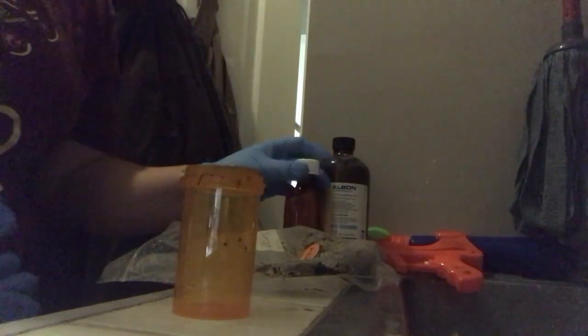So the first thing I'm going to do — I go to my vet's office and I get the solution. It's almost like a sugar solution, and she gives me a small bottle of it and I don't have to pay for it. I had to go pick some more up because I was out of it. The next thing I use is just an old pill bottle, and here's my fecal sample that I collected this morning from him.